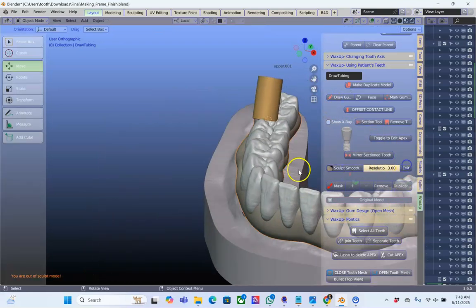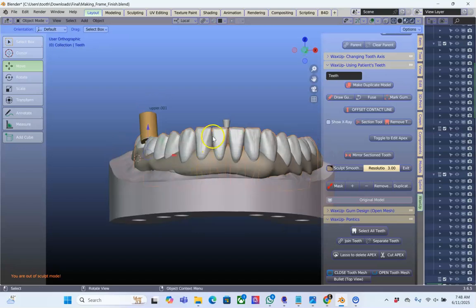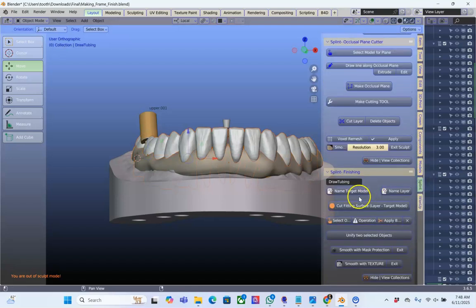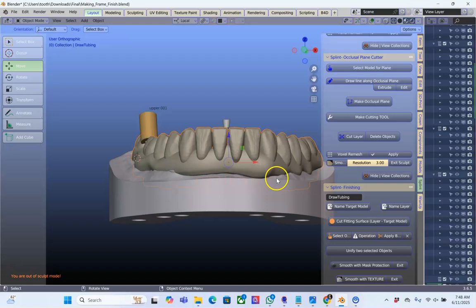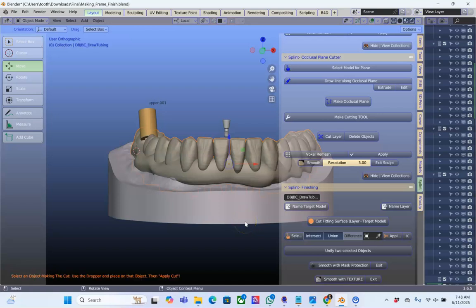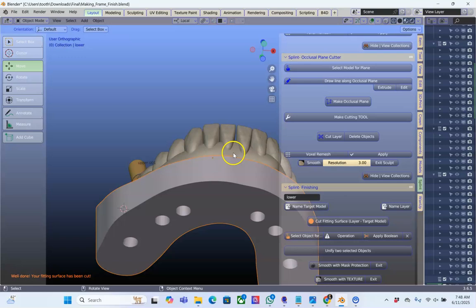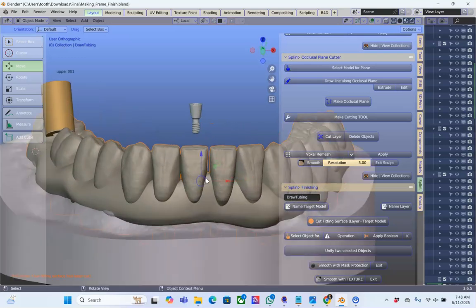Okay, great. Now we're going to unify this to our tissue over here. So select. You can go into the splint module as well, or at the bottom you've got to unify objects. Great. Okay, the color's gone. That's okay. So select this one. This is an object being cut, and then cut. Apply that to make your cut. So now this looks like this if I hide that. Oh, it hasn't done my cut. I'll just go back a step.